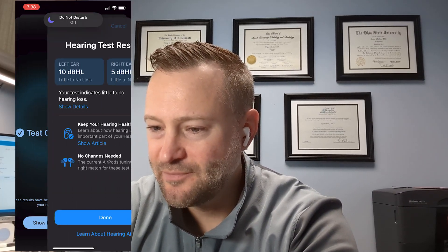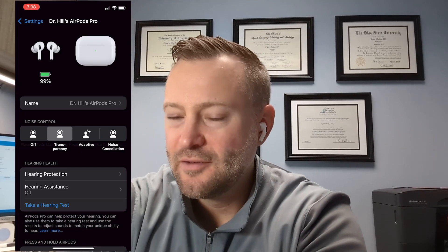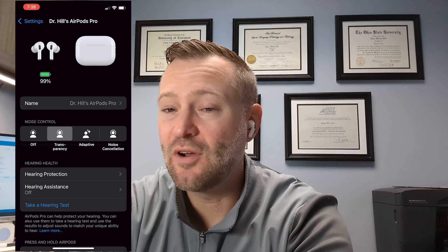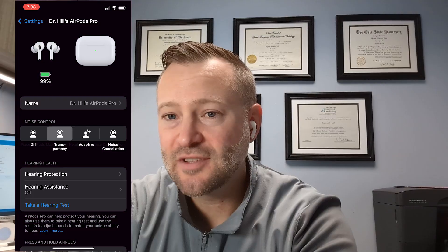Let's go ahead and look at what the results say: little to no loss in both ears. That was expected — I have normal hearing, so it's not going to give me any hearing assistance because I don't need it. The hearing test itself is pretty straightforward; you're just listening for some tones. It's really similar to the pure tone audiogram we give patients — it's assessing sensitivity at different frequencies in each ear on a dB, or decibel, scale, which is about sound pressure in the ear. This determined that normal sound pressure is needed in my ear.